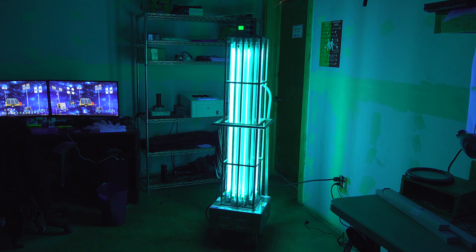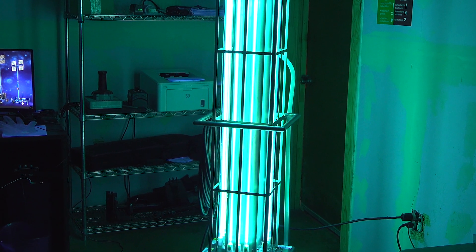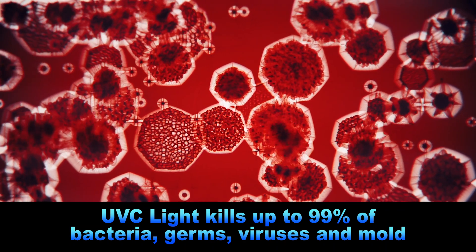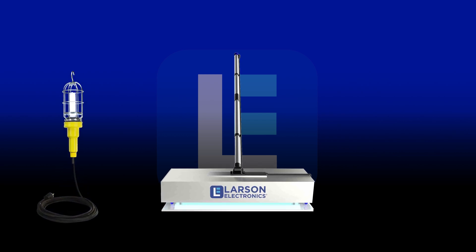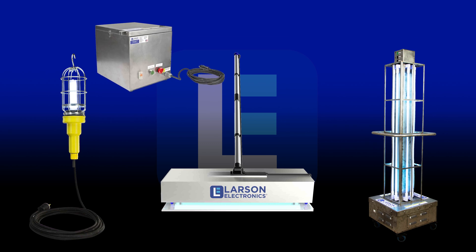The power of UV light is undeniable, disinfecting and sanitizing air, water, and surfaces, and killing up to 99% of bacteria, viruses, and other contaminants. There are many different types of UV sanitation devices for various needs, including UV disinfection brooms, UV handheld wands, UV sanitation carts, UV disinfection boxes, and more.